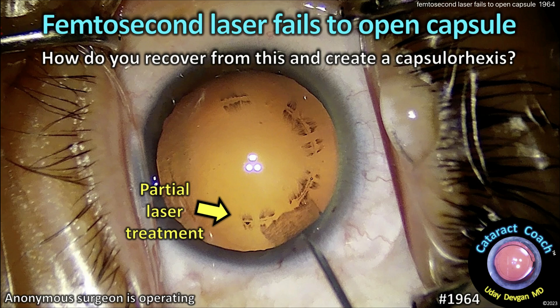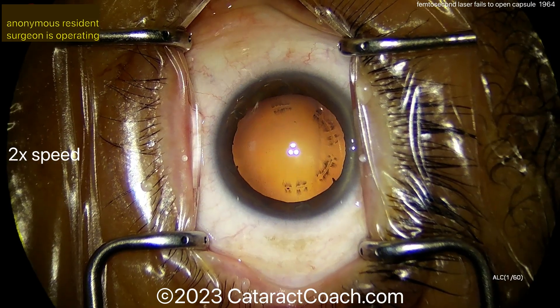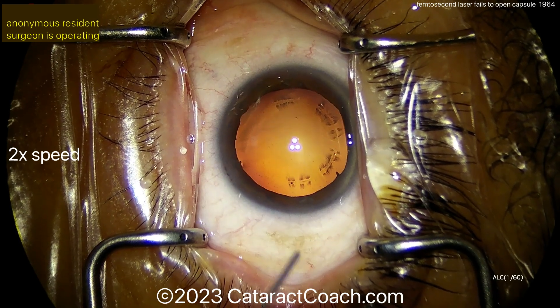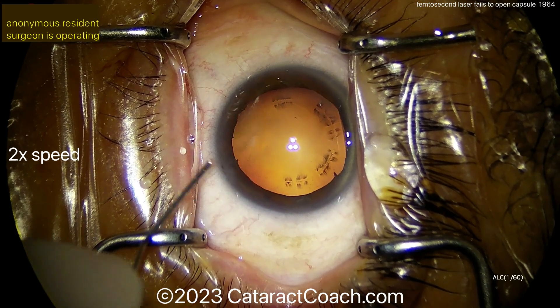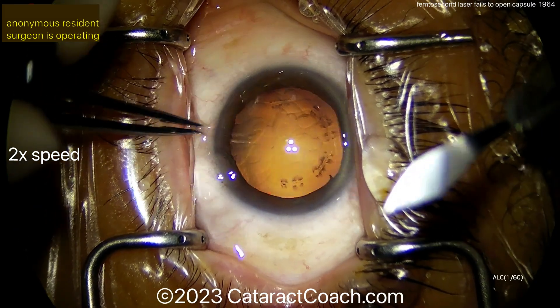Cataractcoach.com. The femtosecond laser fails to open the capsule — so how do you recover and create a capsulorrhexis? Look carefully at that red reflex: you can see the femtosecond laser has delivered some energy spots into the anterior lens capsule, but not enough. No machine is infallible, especially a half-million dollar laser, so you're going to need to do a manual capsulorrhexis.